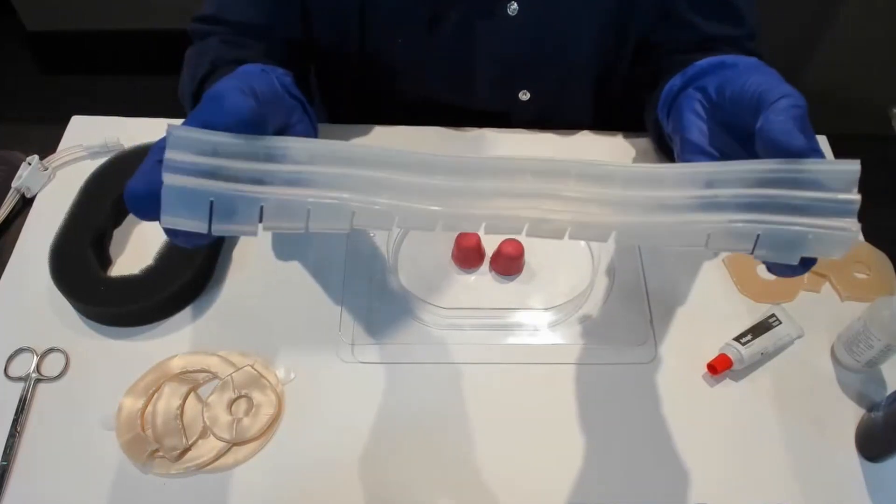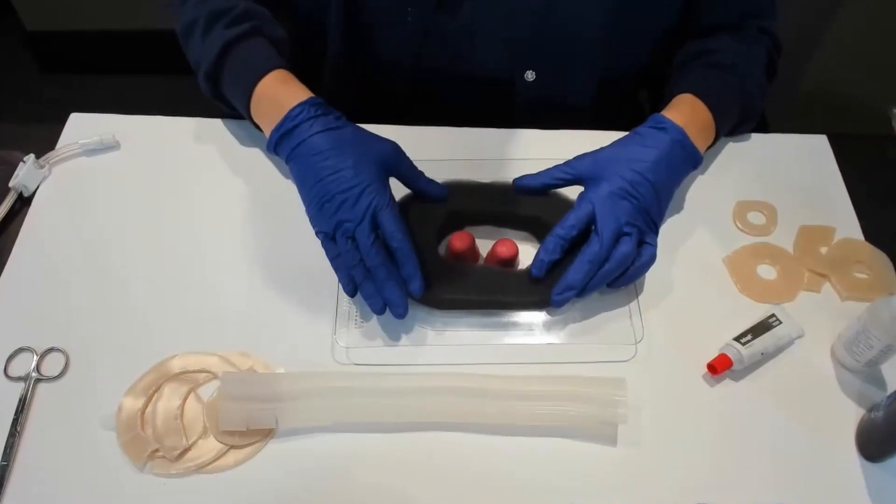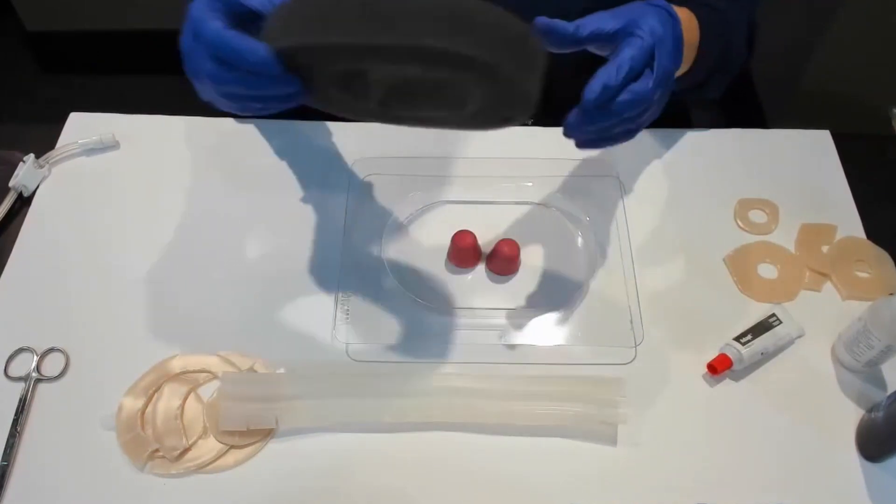I'm going to try and go through each step with you. You want to cut your foam so that it's around your fistulas. That's step one.